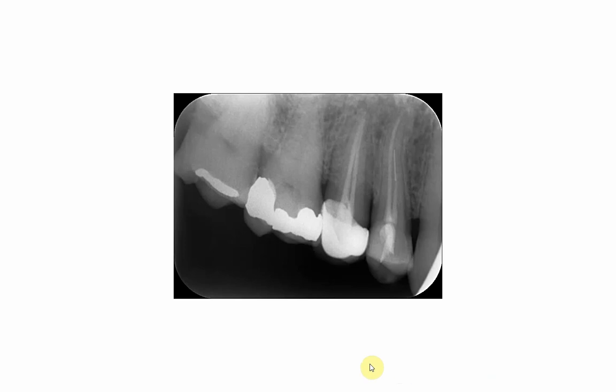Welcome again everybody to a new video. In this series we're discussing the radiographic appearance of restorative materials. In this periapical radiograph you will see a number of different materials that are used to restore teeth, and we will start from the upper seven, the most posterior tooth.